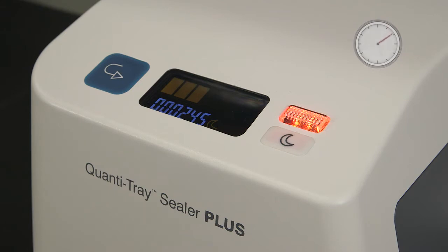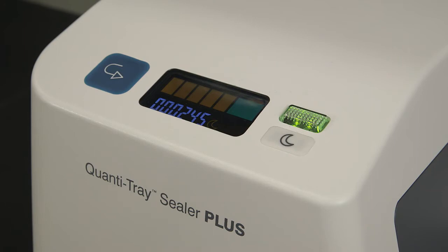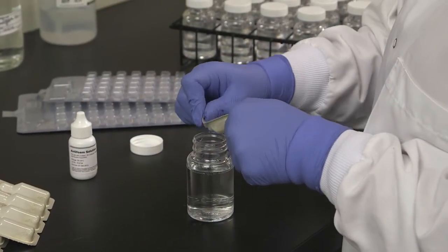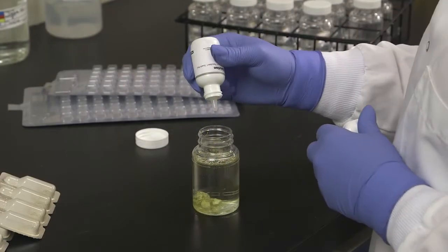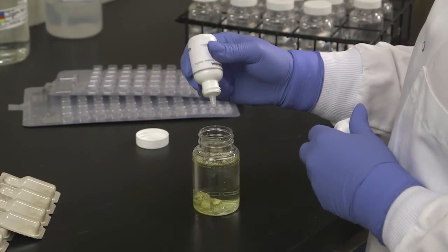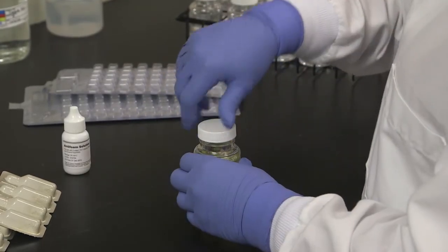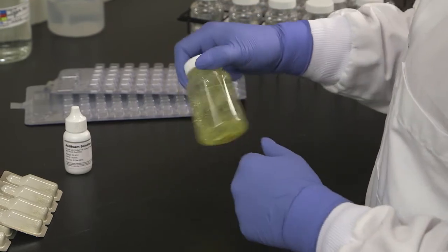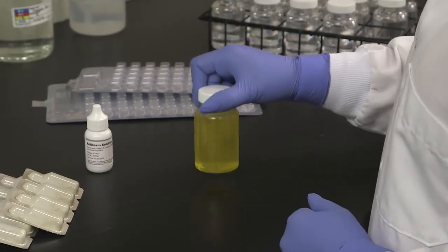Turn on the sealer and wait until a green bar appears on the display. The sealer has now reached operating temperature. Add the ColiShore powder to a 100 ml sample. Add 5 drops of IDEXX anti-foam solution. Cap the vessel and shake thoroughly. Allow the sample to rest for at least 1 minute and then shake thoroughly again to make sure no large media particles remain.